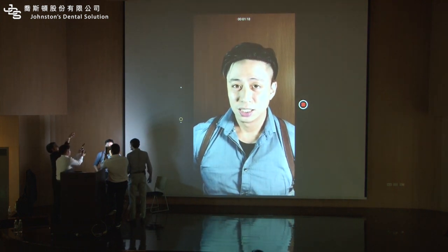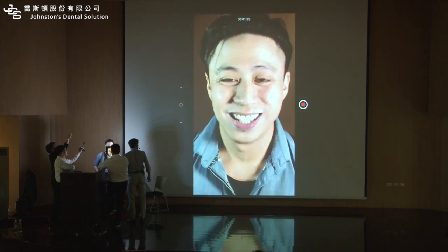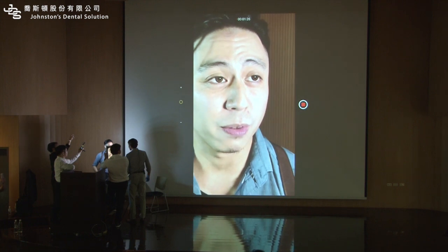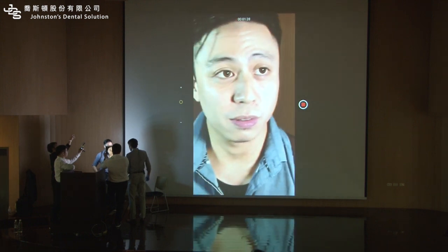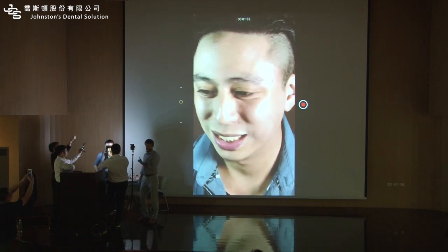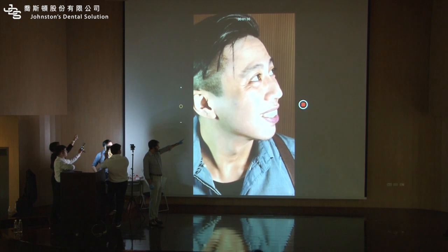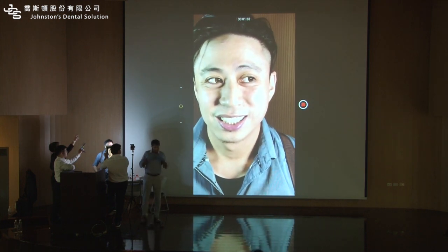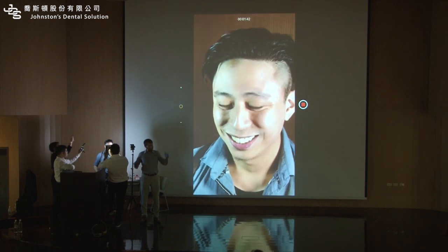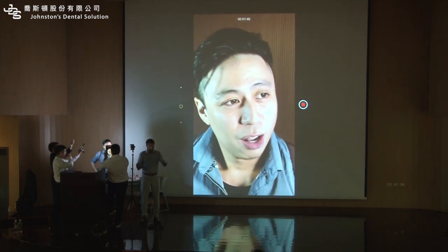Now I want a big smile. Oh. It's a little bigger than before. It's bringing out, yeah. So this is important. You see that it doesn't matter how nice the mock-up looks, patient will always feel like it's too big. Usually because it is too big, but even if it's not too big, anything in the mouth feels super big.